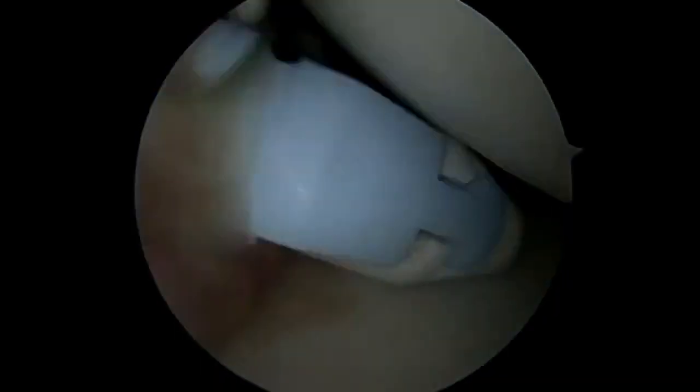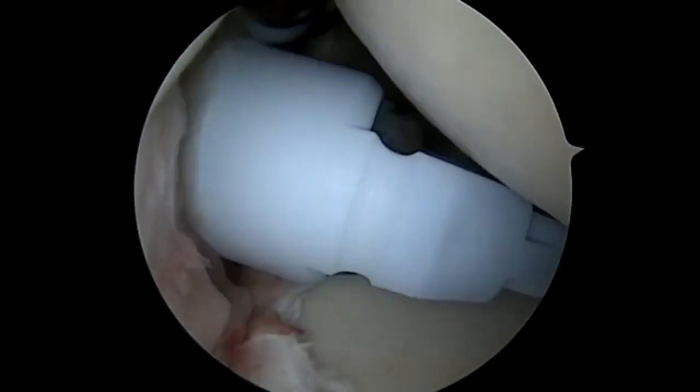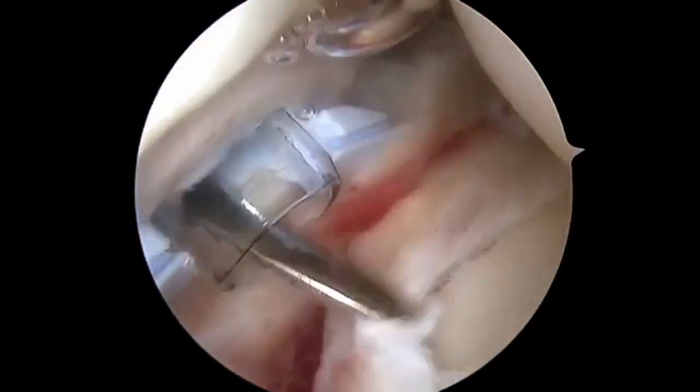Next, we're going to bring in a working cannula. This particular cannula has wings that deploy that keep it from pulling out of the shoulder joint while you're working, an improvement over screw-in cannulas, which tend to fall out of the joint frequently. Next, we'll bring in a rasp and rasp the soft tissues to stimulate a healing response.